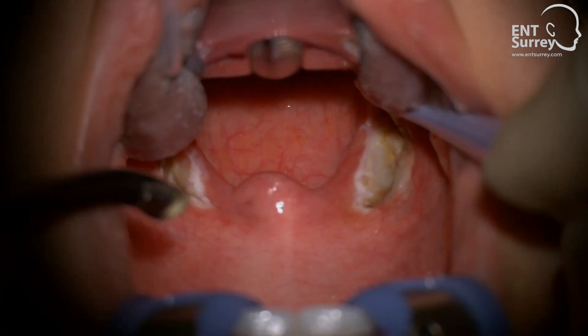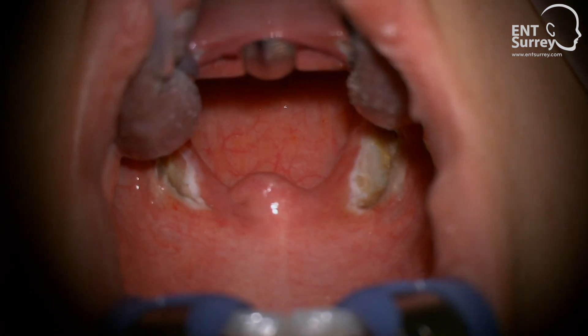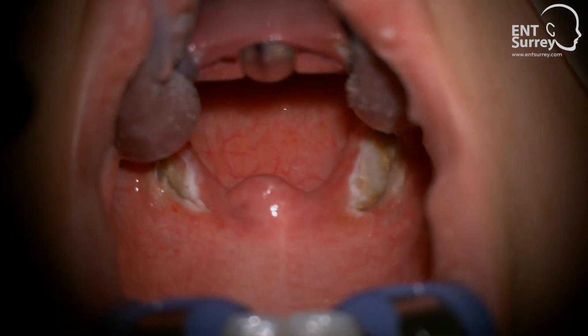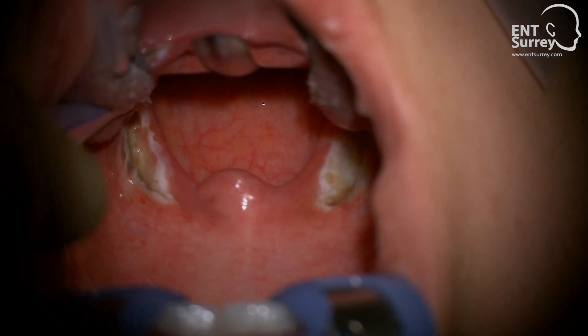As we can see at the end of the operation, the tonsil tissue has been removed all the way up to the capsule, but the normal mucosal structures have been largely preserved, which results in a speedier recovery and less discomfort than with conventional extracapsular procedures.